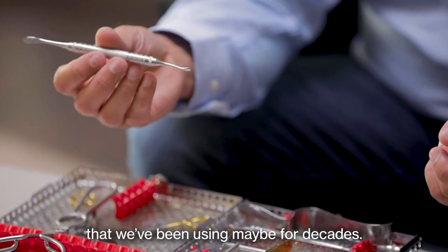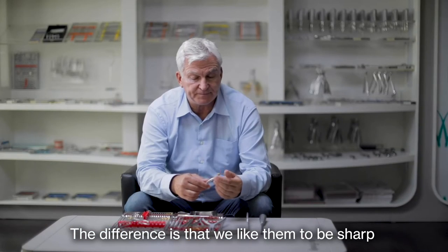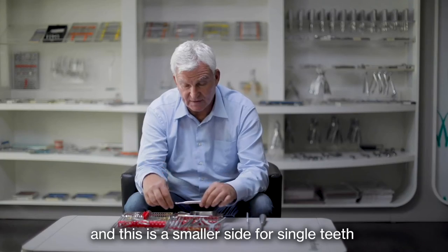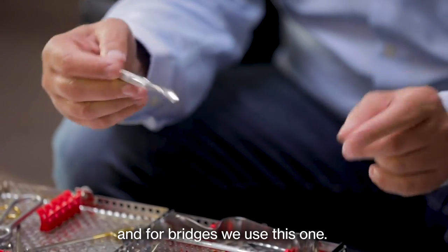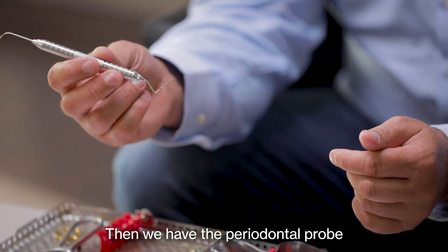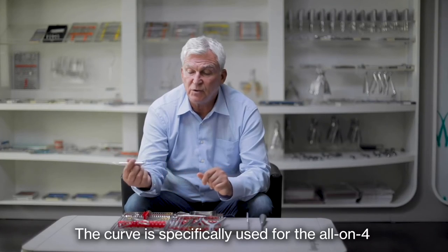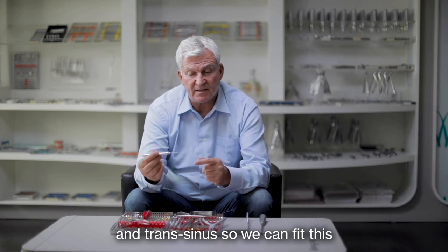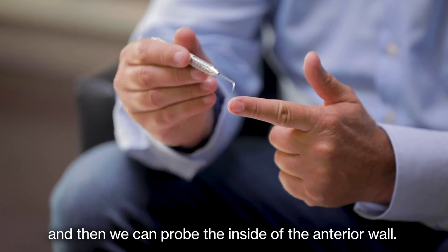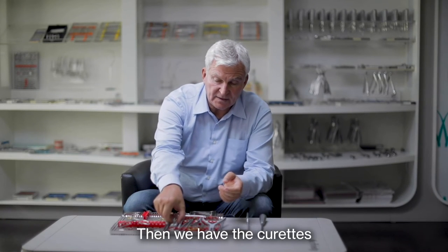Then we have the periosteal elevators, which are normal instruments we've been using for maybe decades. The difference is that we like them to be sharp, because we want to push the periosteum out cleanly. This is a wider side and this is a smaller side — for single teeth and bridges we use the smaller one. Then we have the periodontal probe: one side is a standard periodontal probe and the other side is curved. That curved side is specifically used for the all-on-four and trans-sinus procedures — we fit it on the window we open on the sinus and probe the inside of the anterior wall.